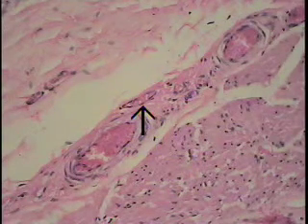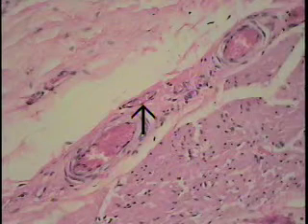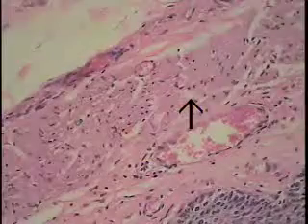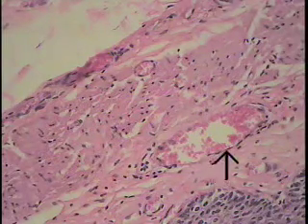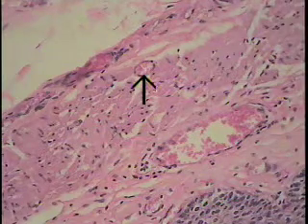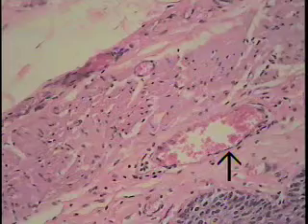A small blood vessel is here, primarily an endothelial layer with a little bit of adventitia, 2 to 3 red cells wide. So this is more the caliber of a venule, and there's some more venules located here of the smaller variety. A small vein shown here. Again, only an endothelial lining with a little bit of supporting intima out about this far. And this is a tiny caliber, or much smaller caliber vein shown at this particular location. Notice the absence in both of these instances of smooth muscle in the wall.